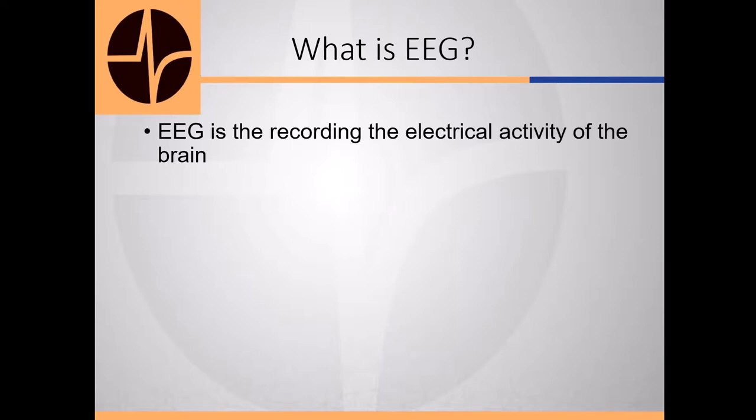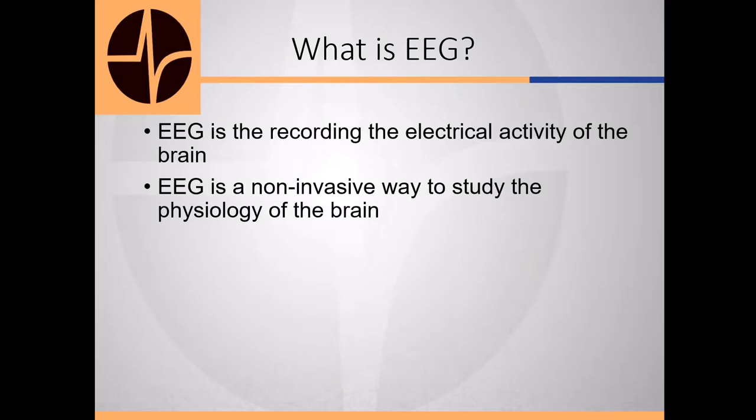EEG is recording the electrical activity of the brain. So every one of us sitting here listening to this has EEG going on. It's like the EKG for the heart. It's just much more complicated. It's electrical activity. It's a non-invasive way to study the physiology of the brain.